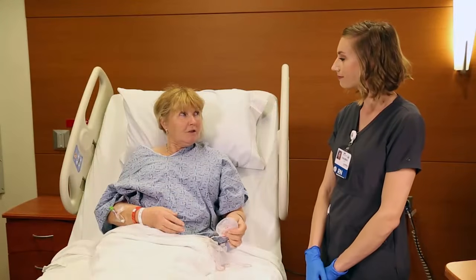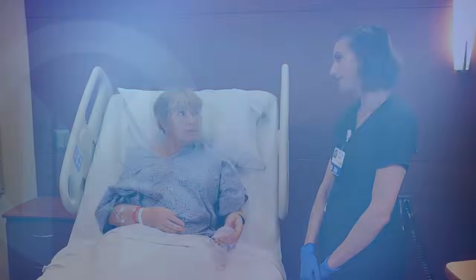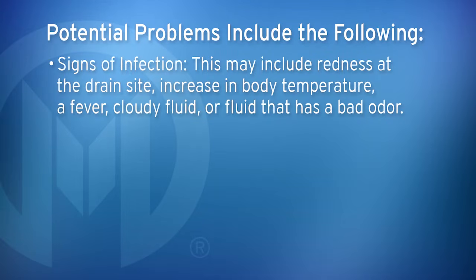You said I should empty the drain 3 times a day and when needed. Are there any problems I should be looking out for? That's a great question. Potential problems may include all of the following. Any signs of infection. This may include redness at the drain site, an increase in body temperature, a fever, cloudy fluid, or fluid that has a bad odor.